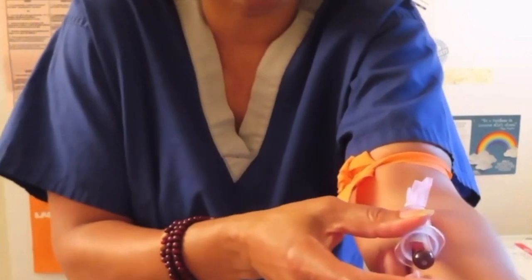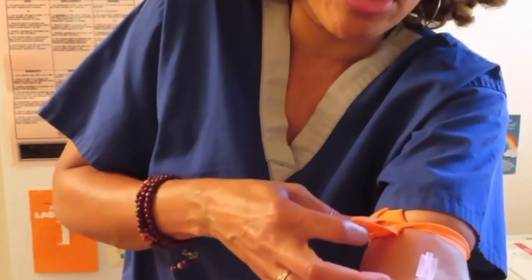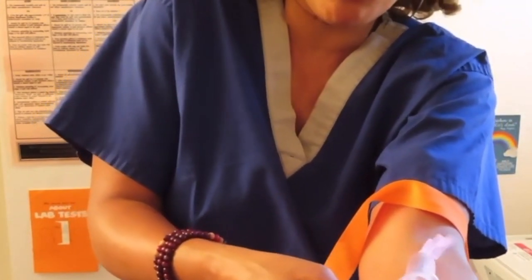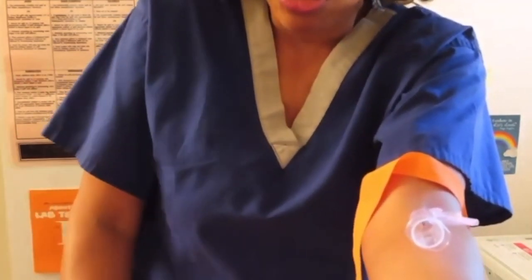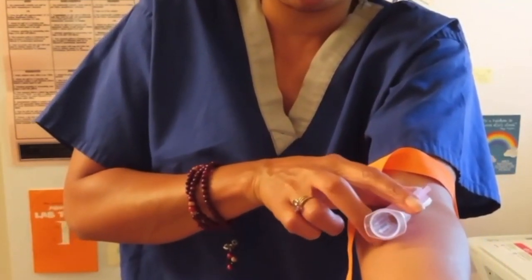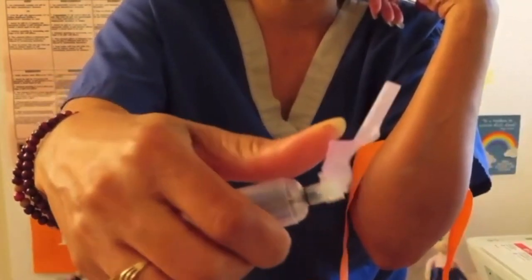Now, you guys do know that since this is the only tube that we need, go ahead and release your tourniquet. Remove your tube. Invert your tube, if it's one that needs inverting. Set it in a tray or rack so that it's sitting up. That's my tube. And then go ahead and remove your needle. So pop your tourniquet before you remove that tube with your straight needle or any needles. And once you do that, that needle has come out, you go ahead and flip and click.